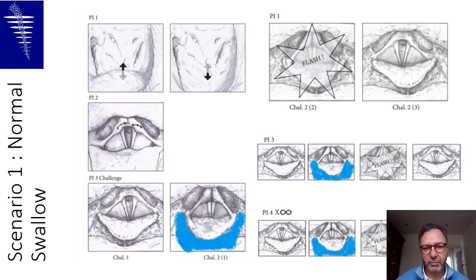The normal swallow will be characterized by several features. At point of interest number 1, you will have a complete normal elevation of the soft palate, which is completely mobile and not presenting any bizarre or pathological motion like spasmodic contractions or denervation contractions. At point of interest number 2, you will have a perfectly symmetric and mobile glottis with both vocal folds moving perfectly well with symmetric piriform sinuses.